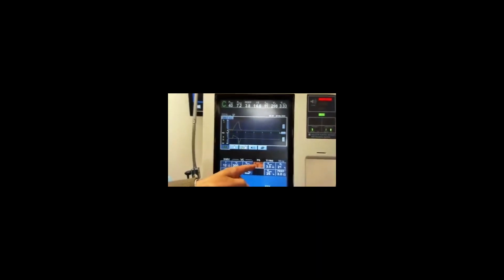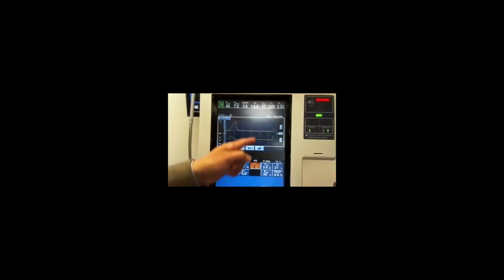If the tidal volume of the spontaneous breathing is 100, you can go up on pressure support until you get 250, 300 at least of tidal volume. So you can play with it, but at least start with 8 and you can go up. If you make it too high, then the patient is being supported almost 100%. Pressure support isn't something that we're going to be using with the ARDS patient.